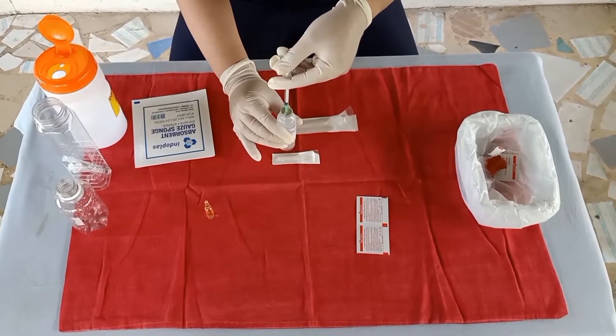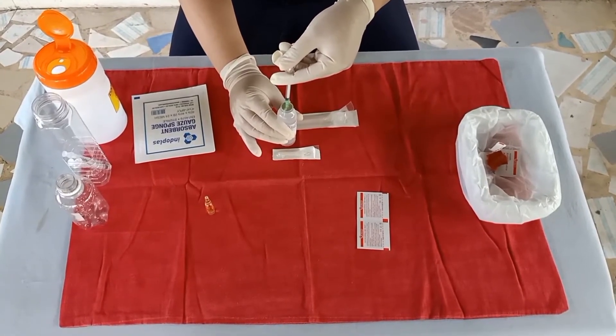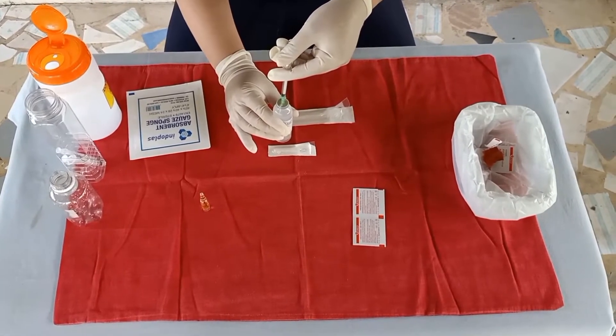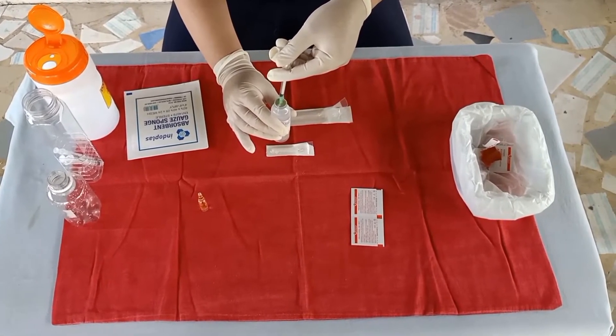Withdraw the prescribed amount of NSS by inverting the vial. Ensure the needle tip is below the fluid level, and gradually withdraw the NSS.